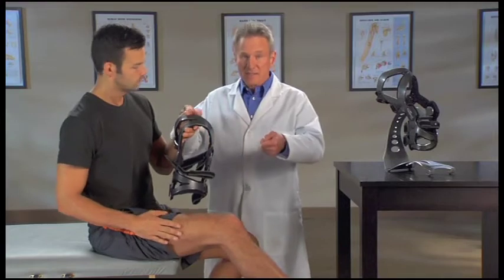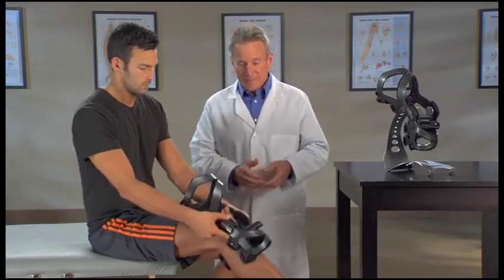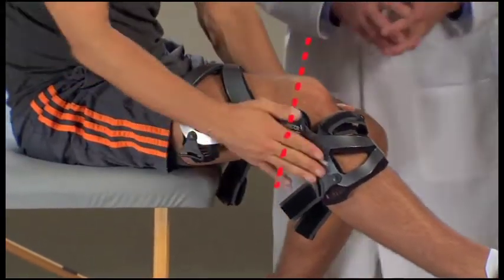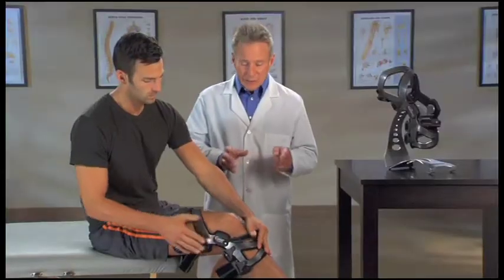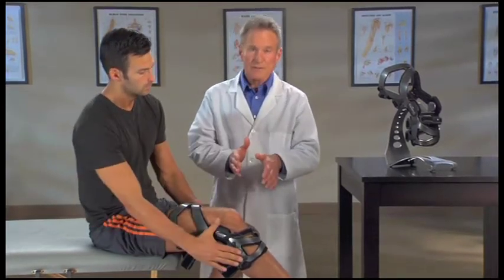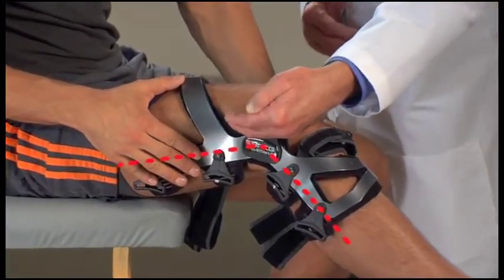With the brace fully extended, slide it down onto your leg. Position the brace so the center of the hinges align with the top of your kneecap. The hinges may be positioned behind your bent knee — this is normal. As you fasten each strap, the hinges will move forward until the brace is properly positioned on the leg, slightly behind the midline of your knee.